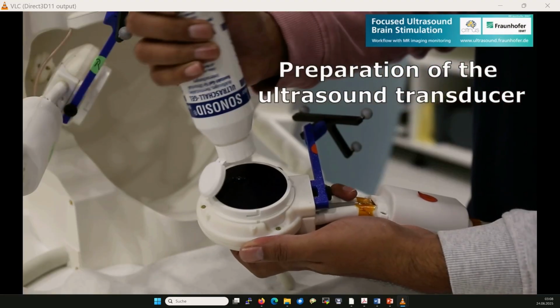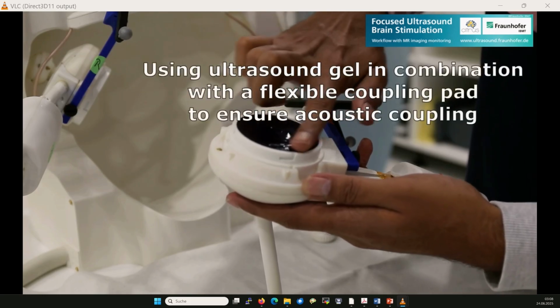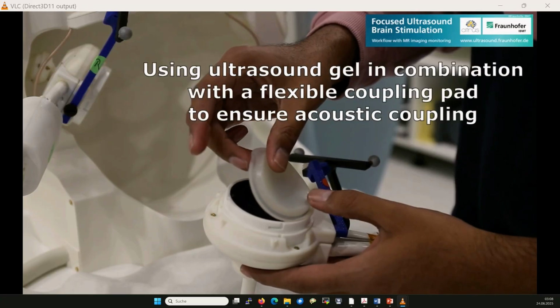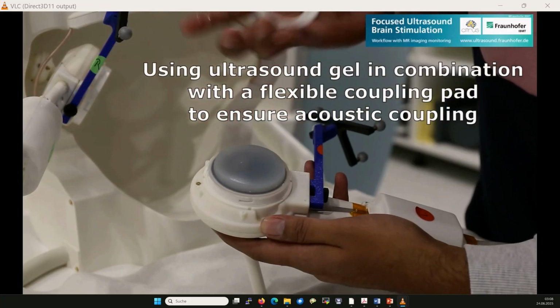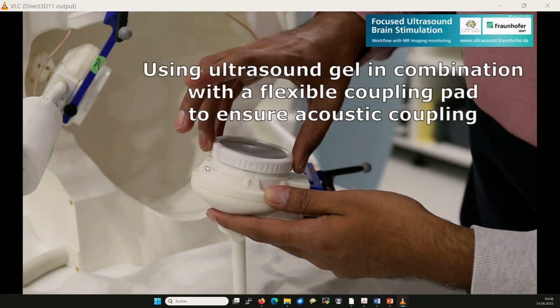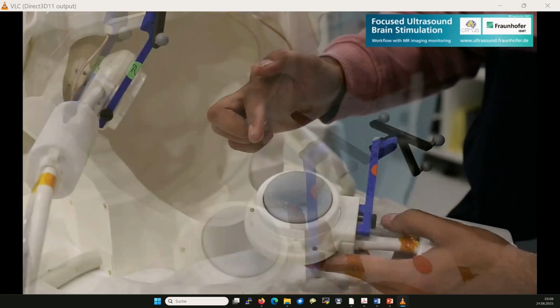Right? You put the gel onto the transducer. You add the gel pad on top of that, right? And then things are ready to be placed on the skull. Then it goes into the scanner.